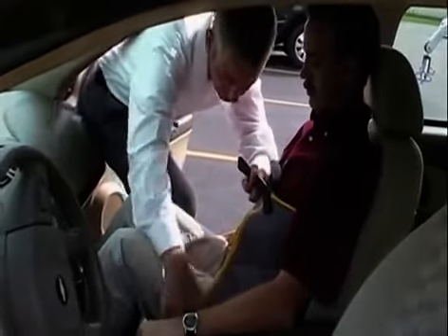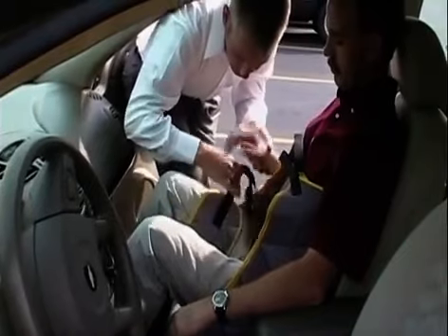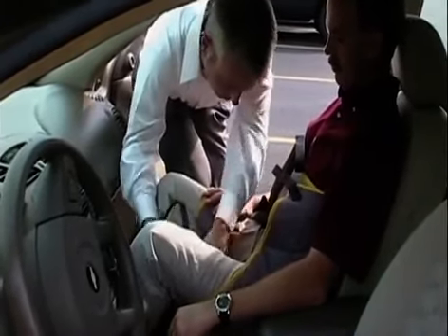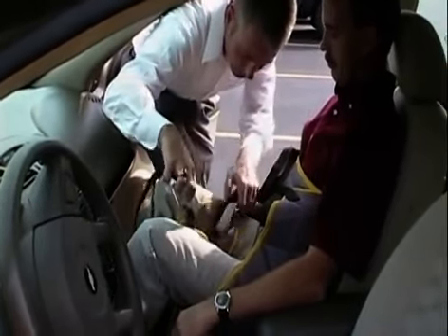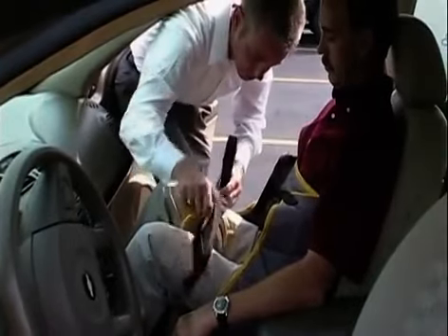Now, I'm going to draw the leg straps down, and I'm actually going to put one leg strap under each leg. Right side — if you can put your hand there for me, that would be great. Left side, and after I've got both in place, I'm actually going to cross these, and I'm simply going to take one and feed it through the other one so that they're crossed.